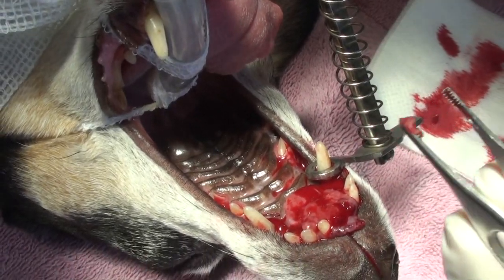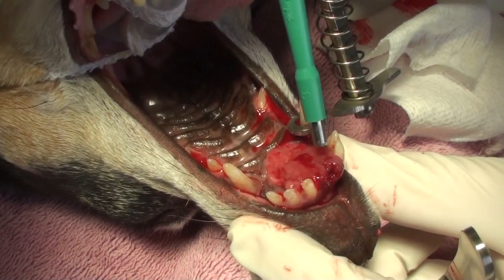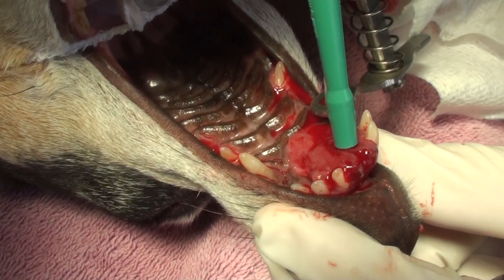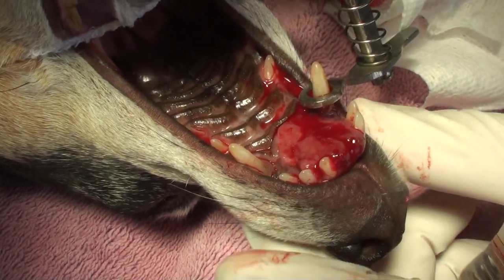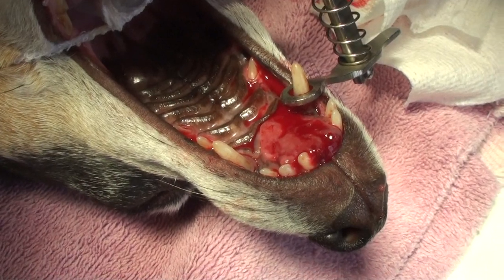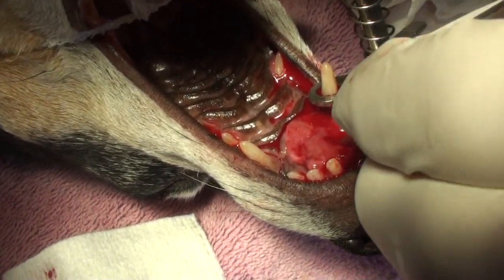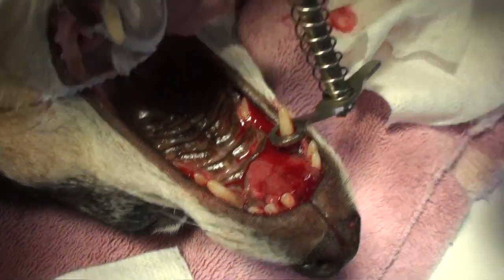That's really all we need. Sometimes we take a couple of sections just to make sure we have cells from different areas. So we take the little piece out — you can see it being pulled out of the area where the instrument cut it out.